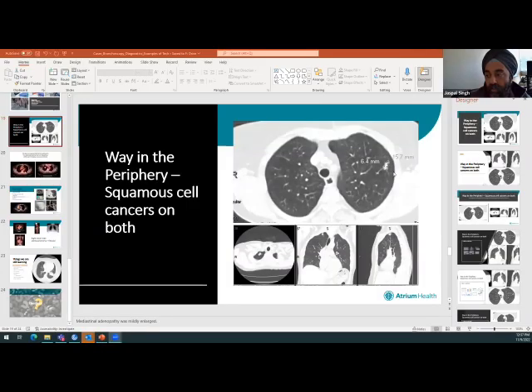Dusty has asked, how deep into the lungs does the robotic device reach? I'm oftentimes shocked. I have to pull back a little bit because we get almost to the pleural surface, almost to the edge of the lung. I think I showed it before. Let me share my screen again. Pretty wild. Way out here, this is right at the edge. So you can almost see the pleural surface. You can come from the inside and go all the way down to the end of the lung.